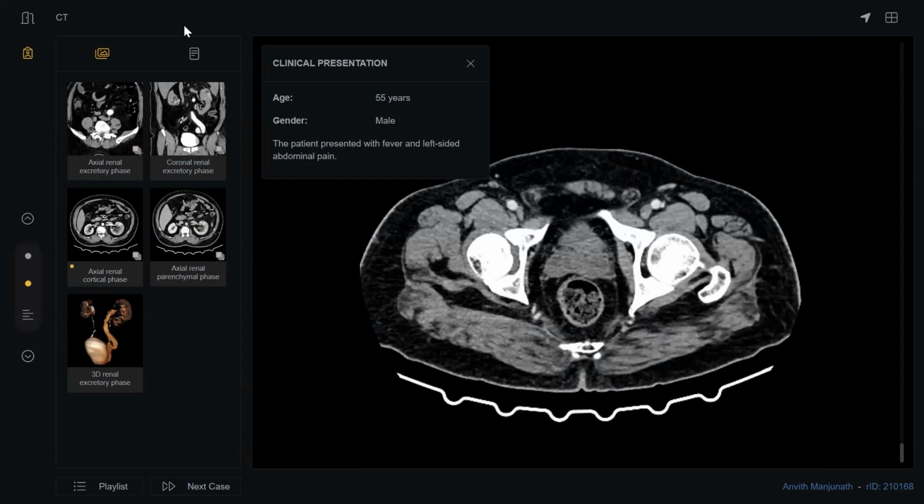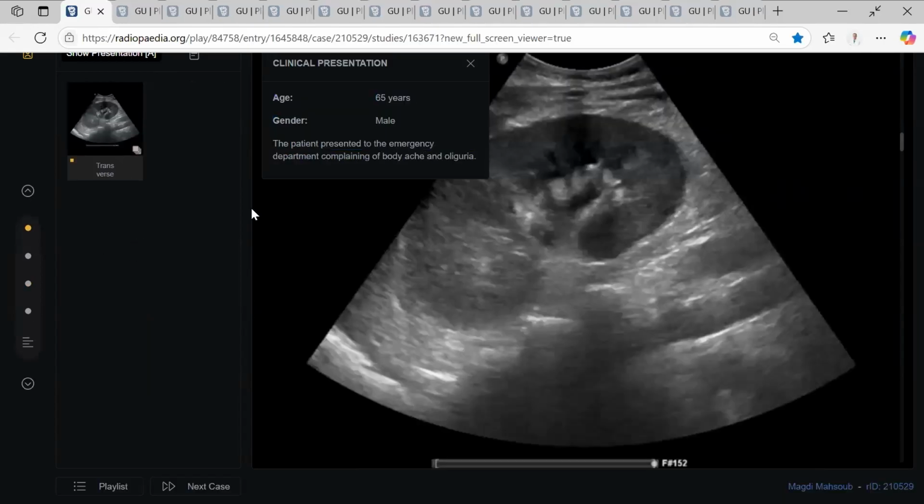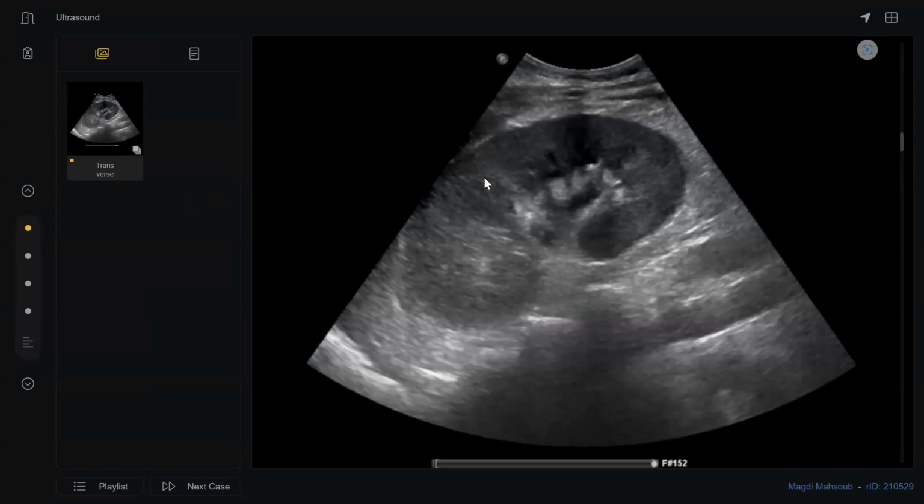Yes, sir. Good afternoon, sir. Welcome. One second. I think this 65-year-old male patient. The patient presented to the emergency department complaining of body aches and oliguria. Can you scroll? Shall I scroll for you? Yes, sir. I requested the remote control. Okay, go on.